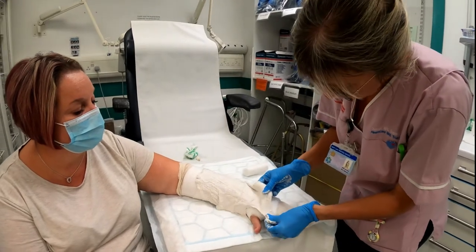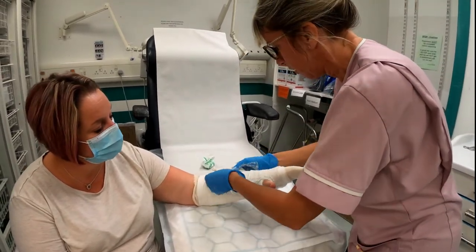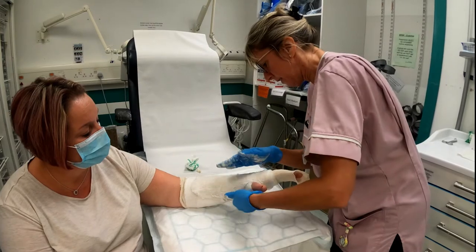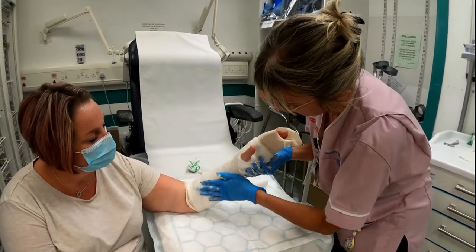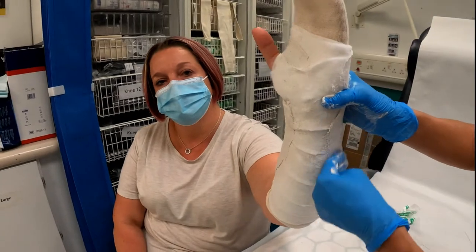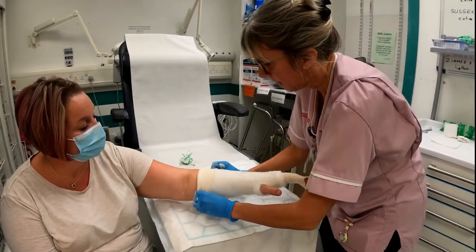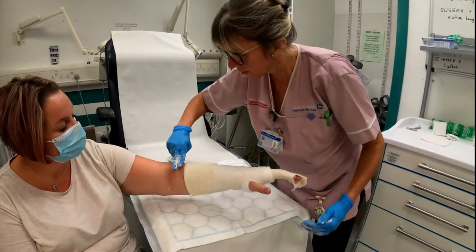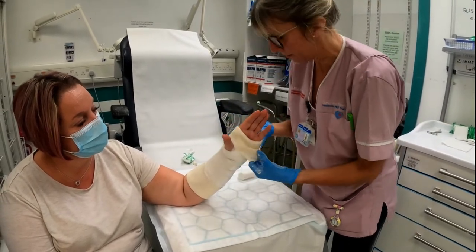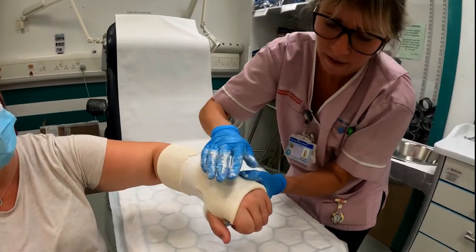Carry the slab over to your patient and lay it on the back. Place the piece that goes into the palm crease first, neatly into the palm, then move the plaster to ensure you cover the radius and the ulna. That's enough to go two-thirds of the way round, and as you can see underneath, it's left a nice decent space to allow any swelling to settle. Fold the ends back — there's our nice two to three finger width space — and fold this end back so it neatly goes around the thumb.